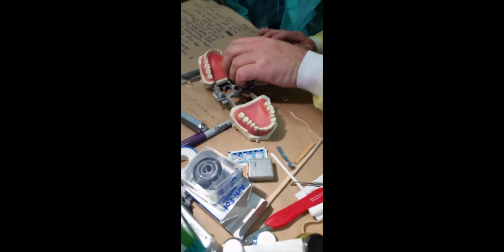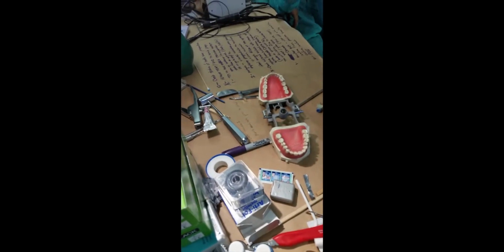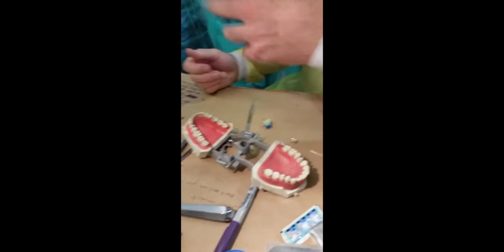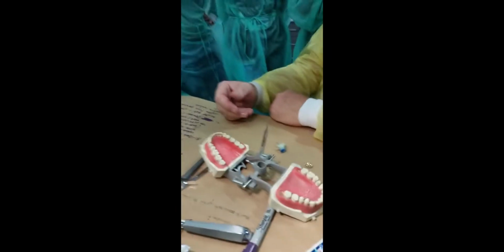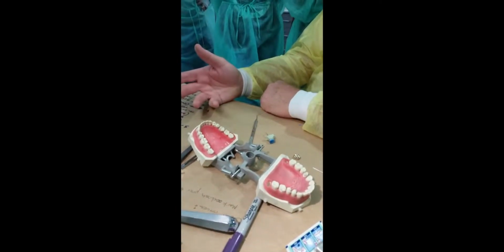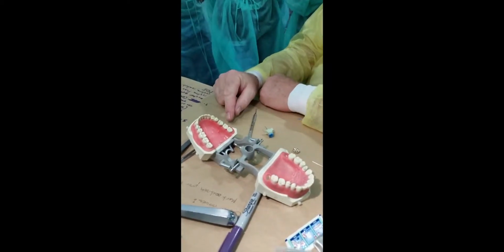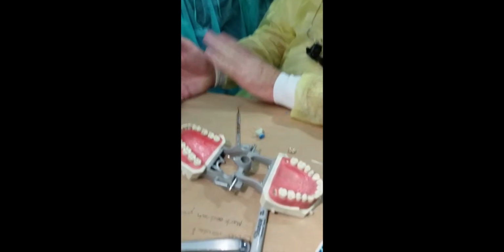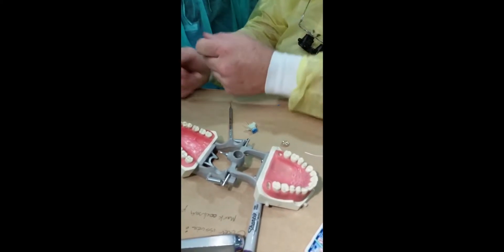So we remove the temporary. You'll generally take a 2x2 gauze, and I forgot to bring that, but that's okay. Just take the corners, spread it out, use it as floss to clean in between, use it to scrub the tooth. It's just a quick and easy way. If you read the text, they always say pumice the tooth. The problem with that is it's going to make the gingiva bleed. It's going to round your margins. So I don't like to do that at all. I would much prefer to just take the gauze and clean it.